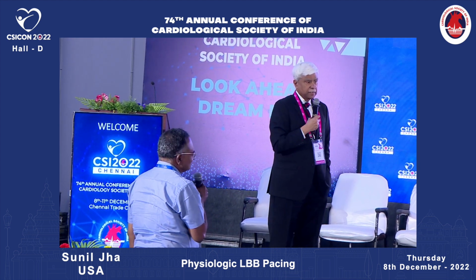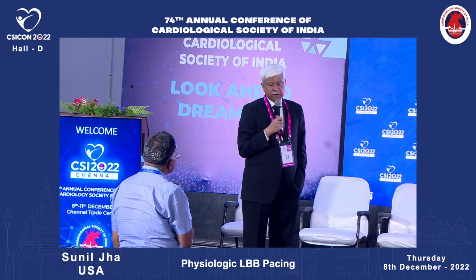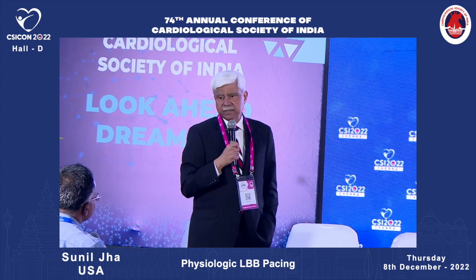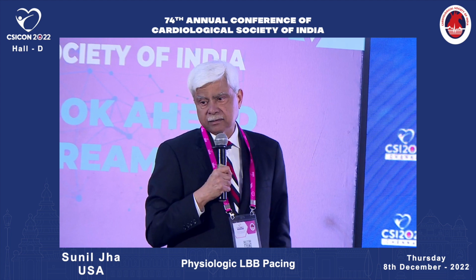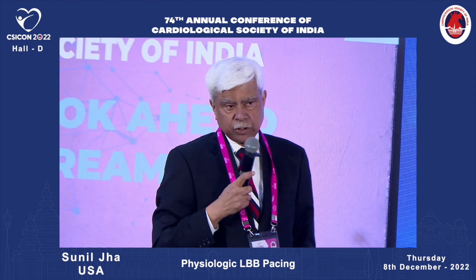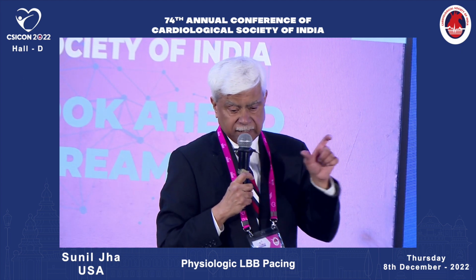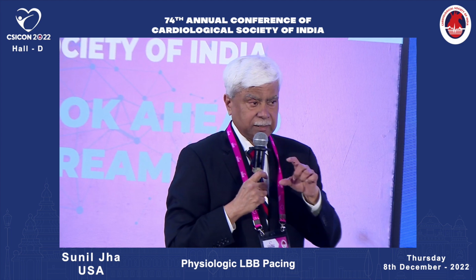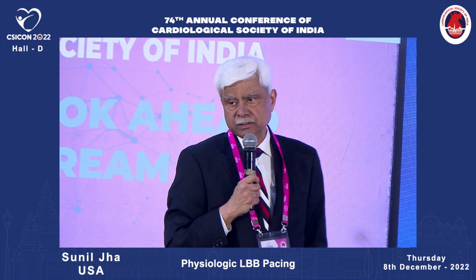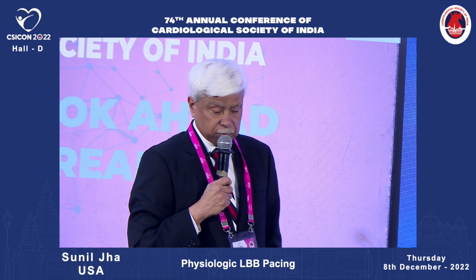Well, I was talking to Sunil that in my place, if there is AV nodal conduction disease or whenever I feel there is a chance of more than 40% right ventricular pacing, I prefer to try left bundle branch pacing. You don't have to, but there is no data saying, okay, this is the LVEF, below that you should do that. But because these are patients who have a high chance of pacing-induced cardiomyopathy, we prefer to do left bundle pacing.